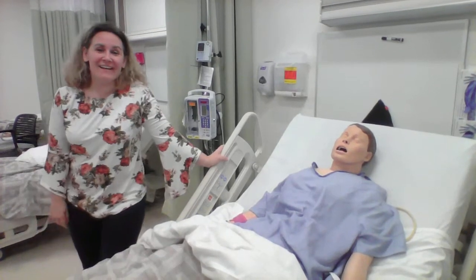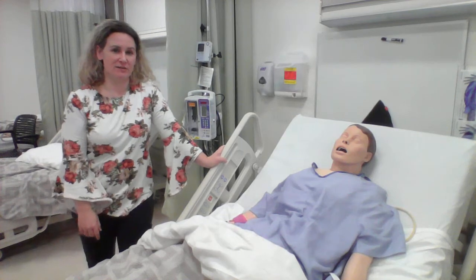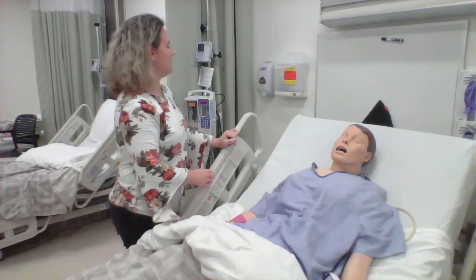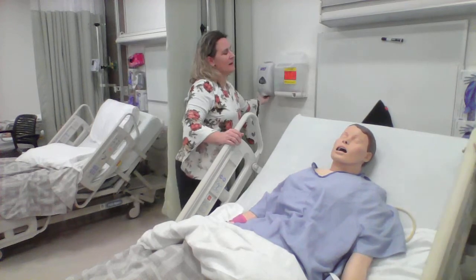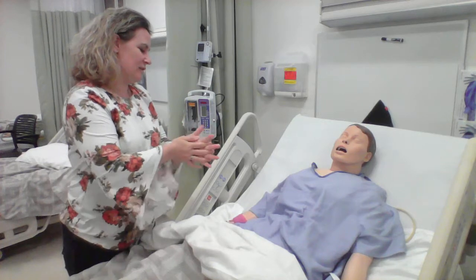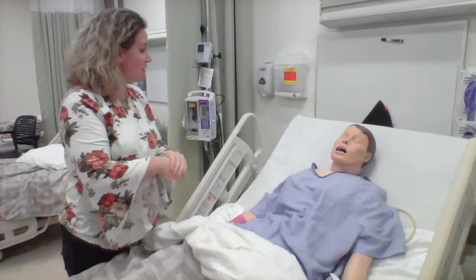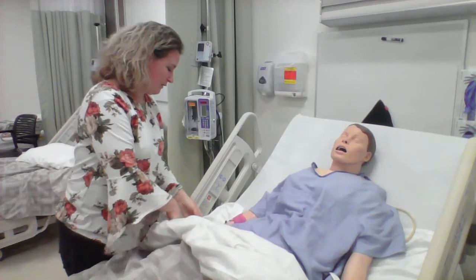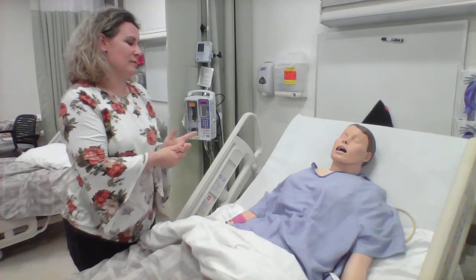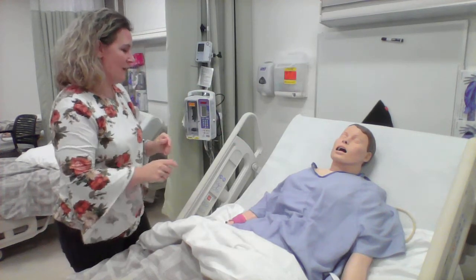Yeah, you're good. Hi, this is NG placement for OSCE second semester. I'm going to go ahead and do that now. Do you mind putting that side rail up? Hygiene, introduce myself. Hi, my name is Lee. I checked your EHR and I see on the record that you need an NG tube placed. Let me go ahead and verify your name and date of birth. Patient states their name and date of birth. I'm in the right place at the right time to do an NG tube for this patient.